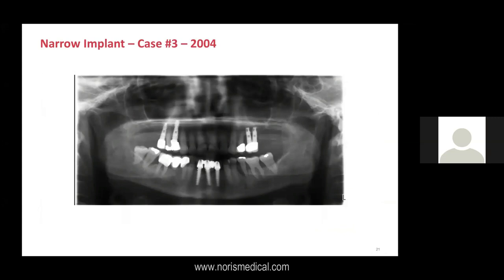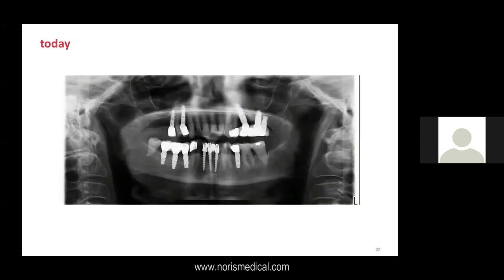Another case, last old case, again, same area, 32 to 42. I don't know even why did I use three implants instead of two. I don't remember really what went. I felt that maybe it is too thin in order to withstand the forces. I made my technician life really difficult. So this is how it looks.